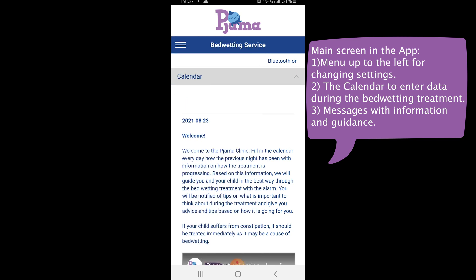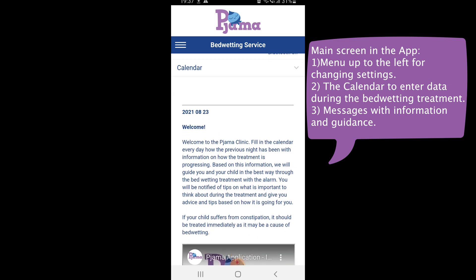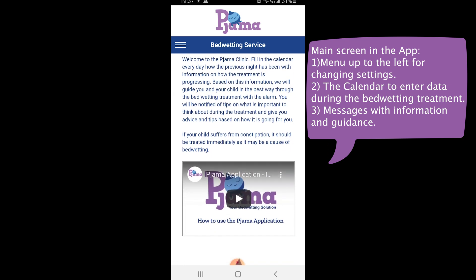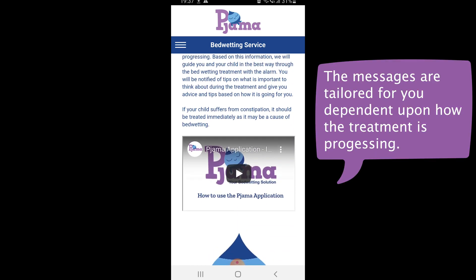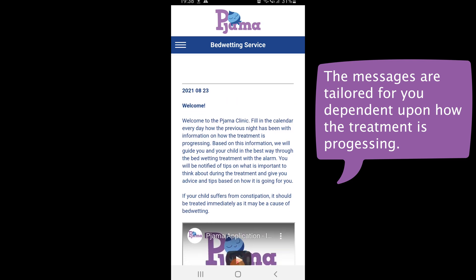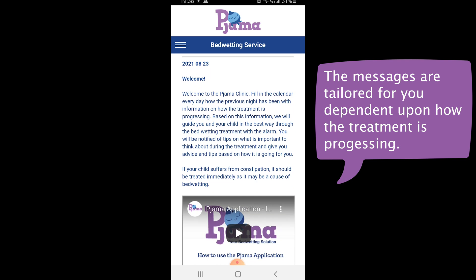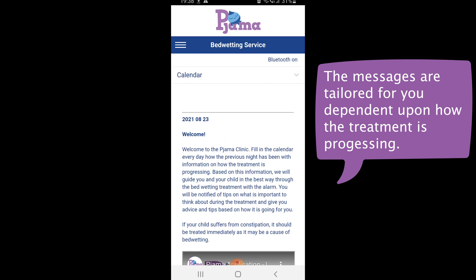The second function is a calendar where data is entered during the bedwetting treatment. And third, we have a section with different messages that are sent to you during the treatment process. These messages are based upon the information that you will enter in the calendar. The information entered is analyzed and you will receive tailored messages that will guide you through the bedwetting treatment with the bedwetting alarm in the best way.